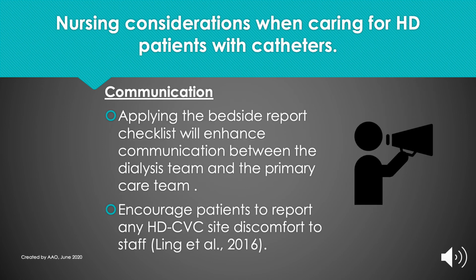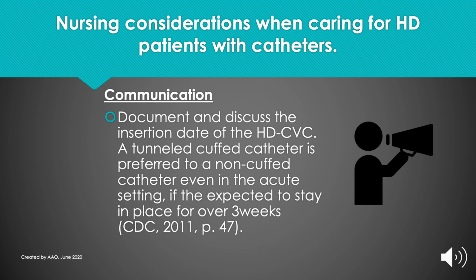Communication, communication, communication. Applying a bedside report checklist will enhance communication between the hemodialysis team and the primary care team. Encourage patients also to report any catheter site discomfort to the staff as soon as possible. Also document and discuss the insertion dates of the HD CVC. A tunneled cuffed catheter is preferred to a non-cuffed catheter, even in the acute setting, if it's expected to stay in place for over 3 weeks.